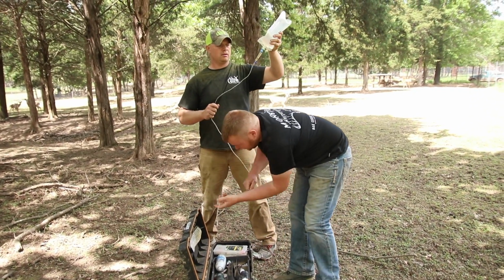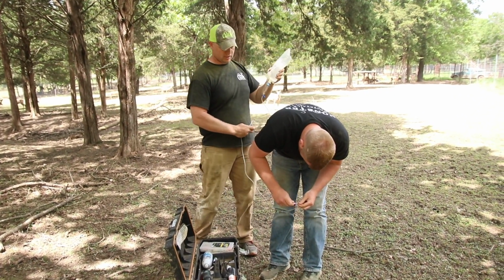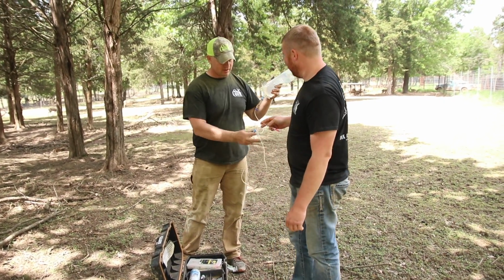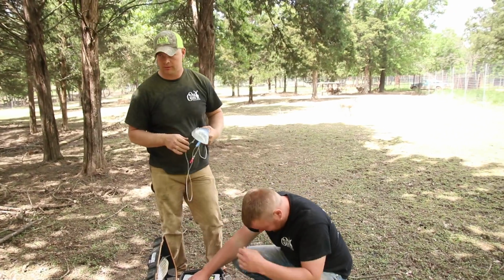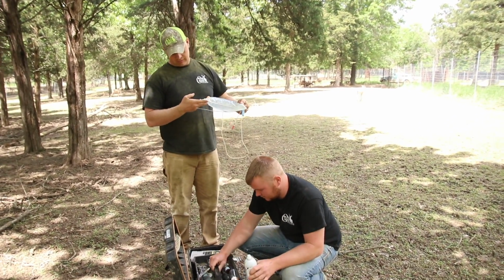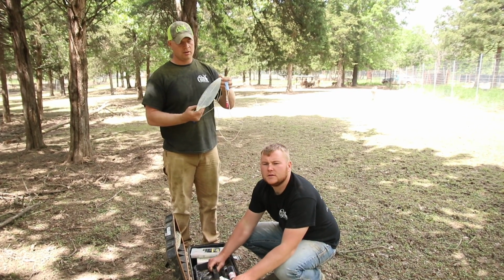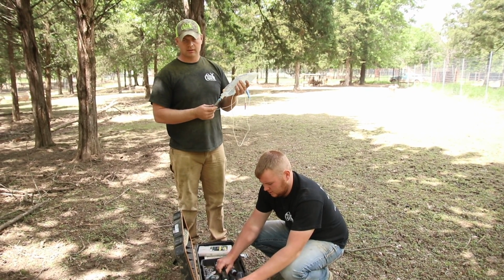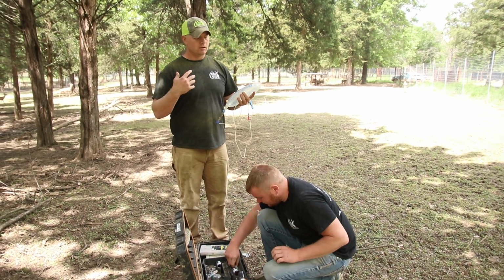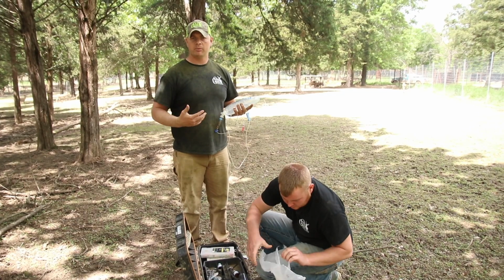There we go. Now Jacob's putting a tip on it, a needle on it. Now I'm going to try to insert this into his vein when we get up there. The reason being is this is a 60 drops per milliliter drip set, and this is going to provide just enough fluids into his blood system to where we can actually help keep him cool.